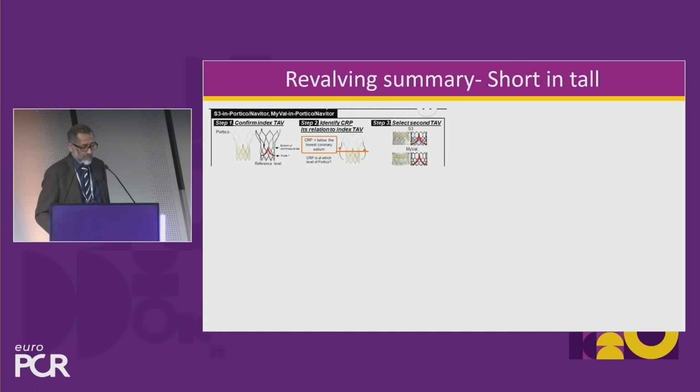So here's a sort of stepwise way. I would almost invariably put a short valve into this tall valve. I just can't get my brain into thinking about a tall valve inside a tall valve. It's too much to think about. So let's talk about a short valve in a tall valve.